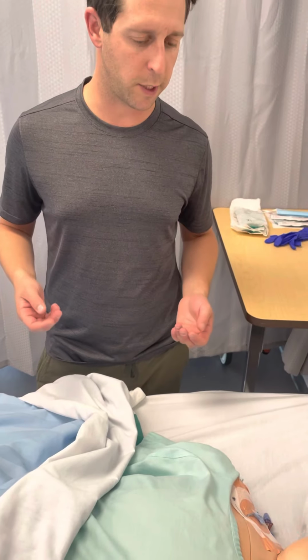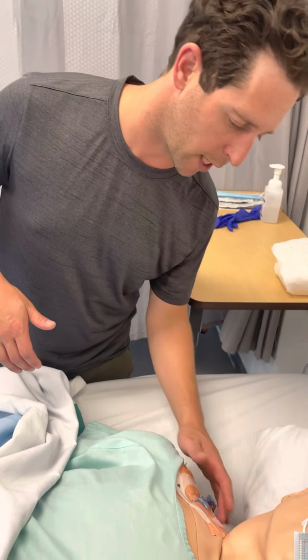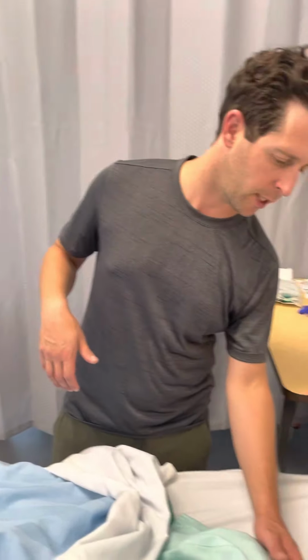Pat, can you tell me what you know about a CVAD dressing change? That's what we're going to be doing today. That's right. It's every 7 days unless it's soiled or loose or leaking. It's none of those things. It's nice and dry and intact, and it is 7 days.